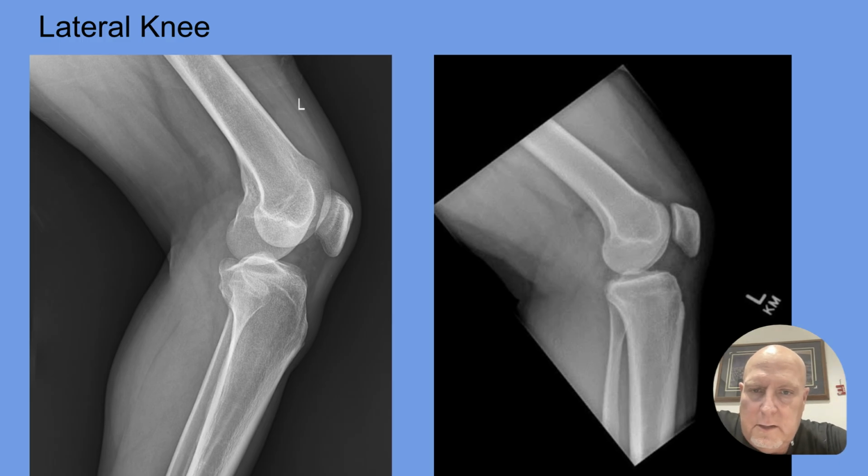As far as medial to lateral angle, it's not too bad. It's not off by very far, just like 2 or 3 millimeters right here. But you can also angle your tube to take care of this lack of superimposition. I prefer to do like a 5-degree cephalic angle. That will put this condyle up here superimposed with this condyle.